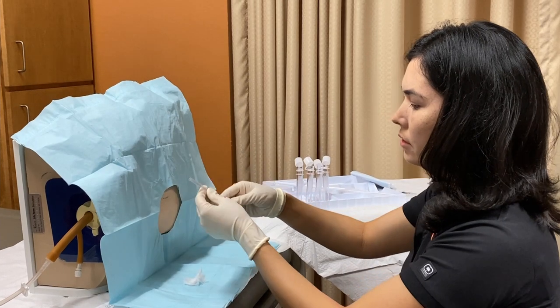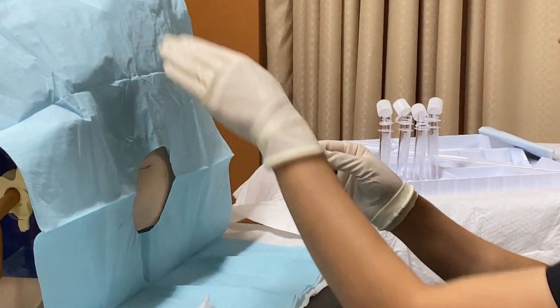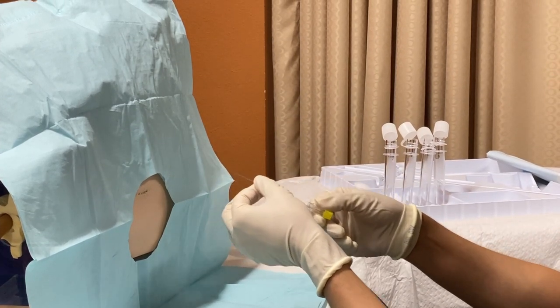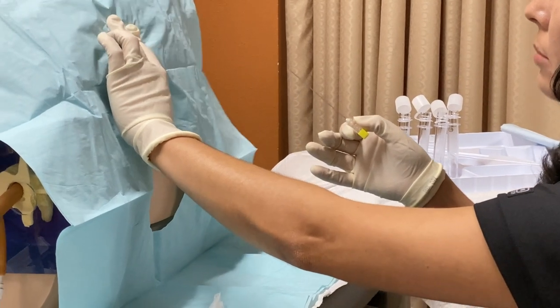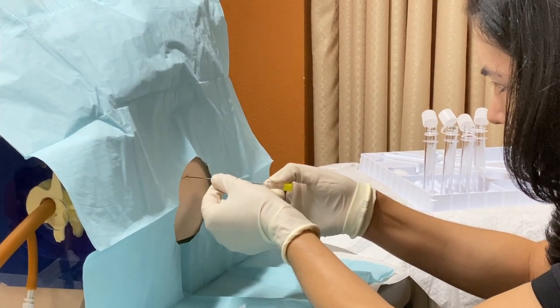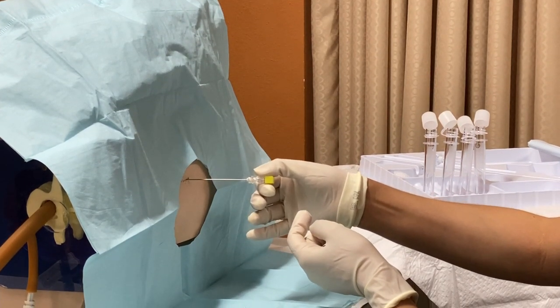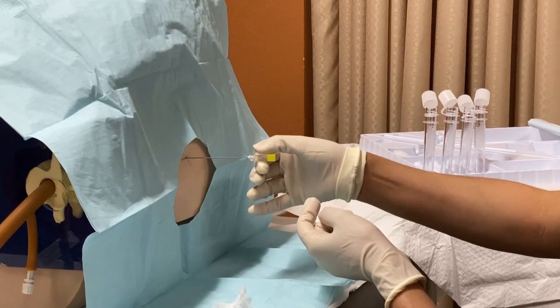Now proceed with inserting your spinal needle. Stylet is in place, bevel towards the flanks. Using the two-handed technique — bevel towards the flanks. Palpate for your landmark, your iliac crest. One important thing: look at your needle — it needs to be parallel to the floor. If you notice your needle is not parallel to the floor, that's a problem and you're not going to get into the right space.